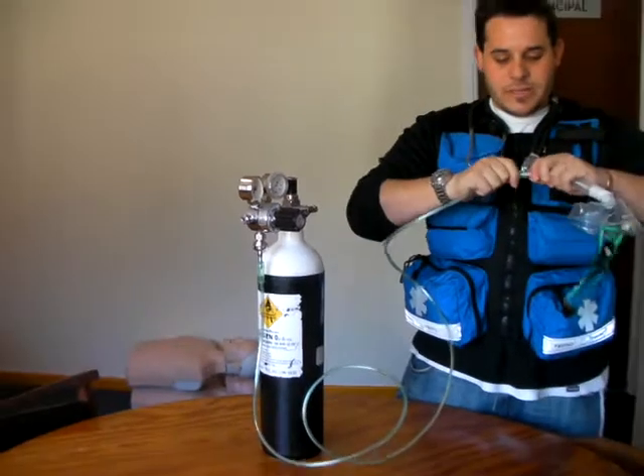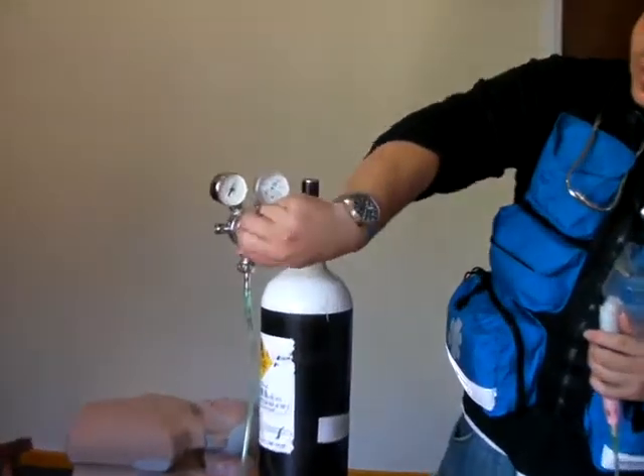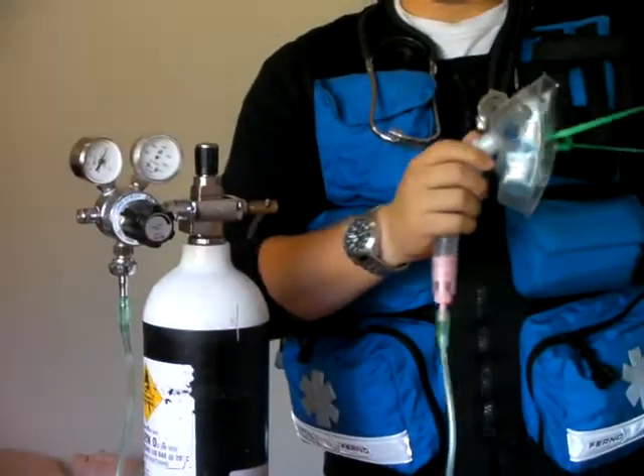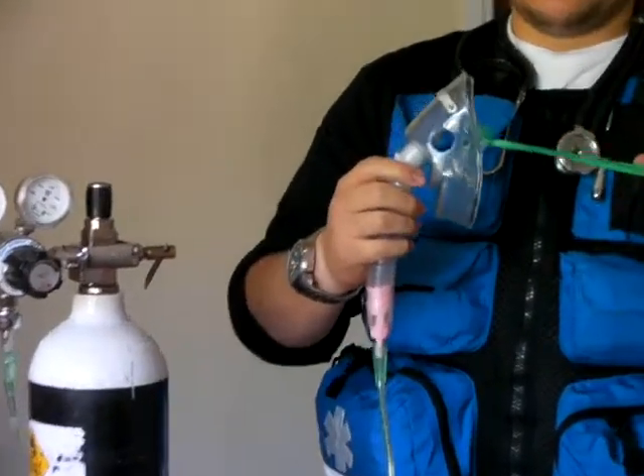This is a 40% mask, which is 8 litres. Turn on the regulator to 8 litres. Once oxygen is flowing, place it over the patient's face.